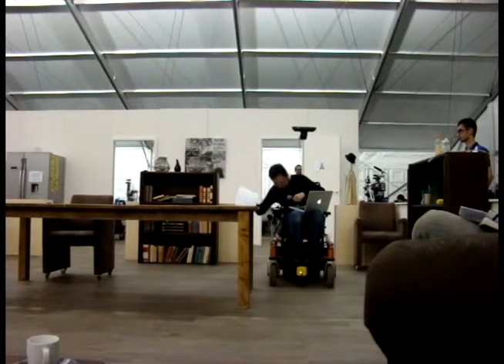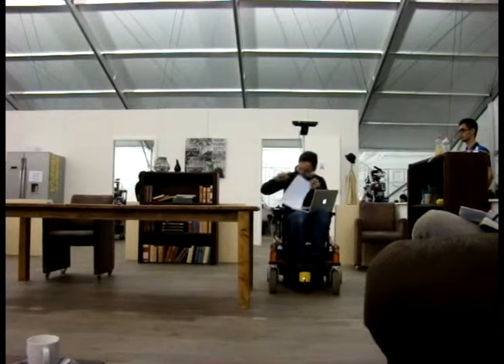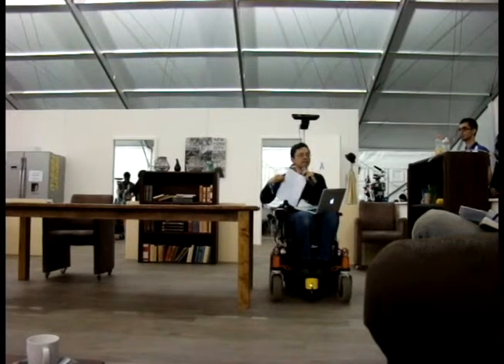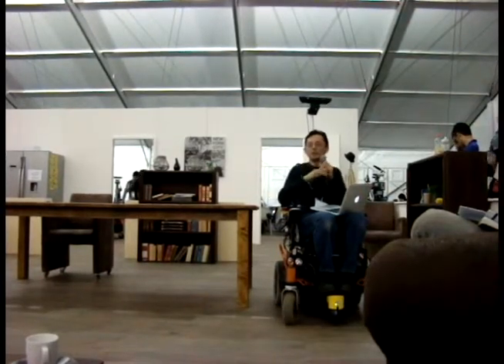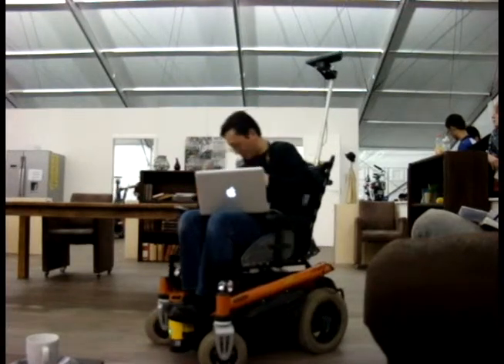Hi, Robert. Okay, so in this case, this autonomous wheelchair is capable of navigating, recognizing commands, of course. We are adding a robotic arm, because the idea is that people that sit in the wheelchair could eventually just guide with commands. I will do examples if it's possible.